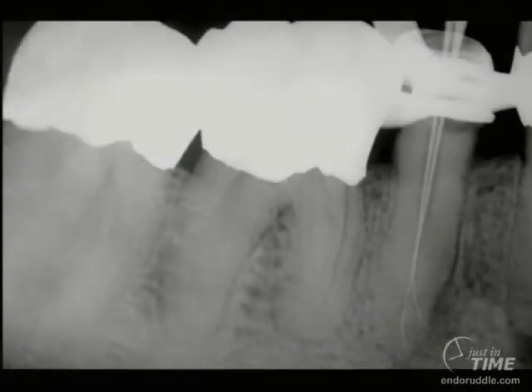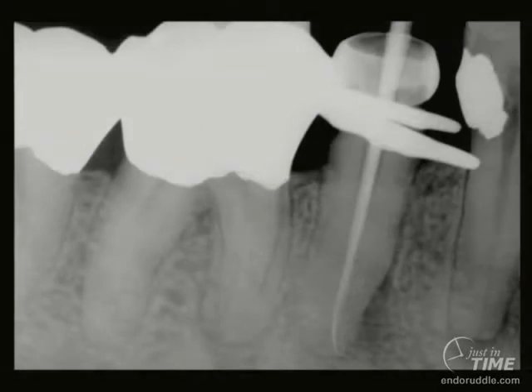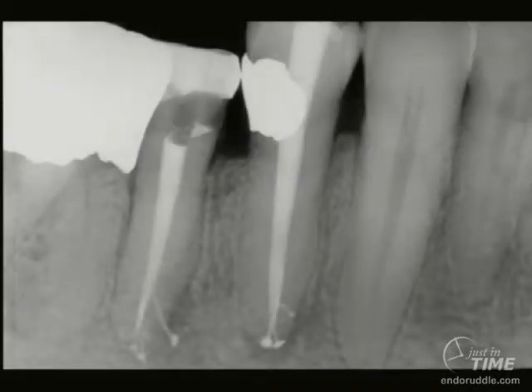In this mandibular second bicuspid, you can see an asymmetrical lesion. The importance of carrying small size files to and minutely through the foramen cannot be overemphasized, because we want our reagents to come off that shaped canal so that irrigants can penetrate, circulate, and clean into a myriad of lateral canals as seen on that second bicuspid. Notice that the first bicuspid has three apical portals of exit. I've always said as a teacher, having done this since the 70s, that there are really only two things left to teach: great access and owning the glide path.